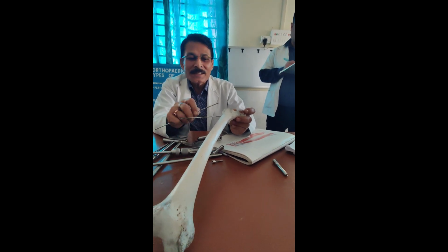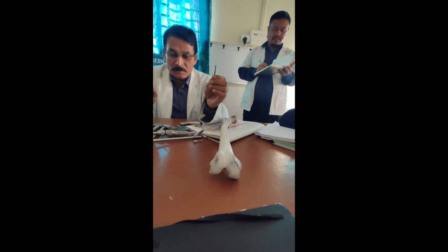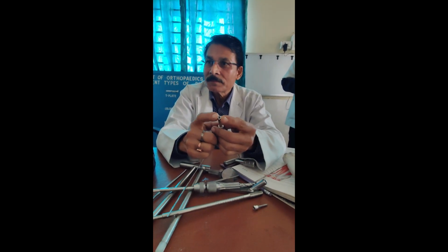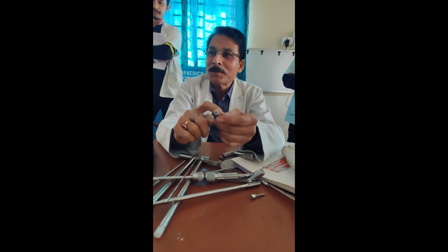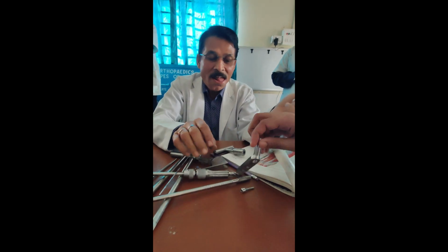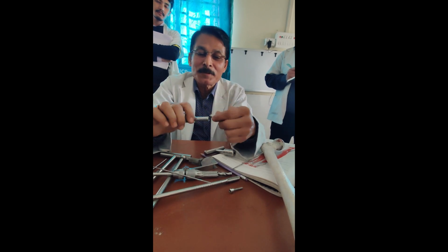Simple. Now wash it away, as the debris will be there. So wash it away, then I am going to put the screw. While placing the screw, there are two things. Look at this screw, see, this part is flat. Yes or no? Yes. This is round, this is flat. And my placement is hard. Look at the plate. This is the plate where this is going to help you.